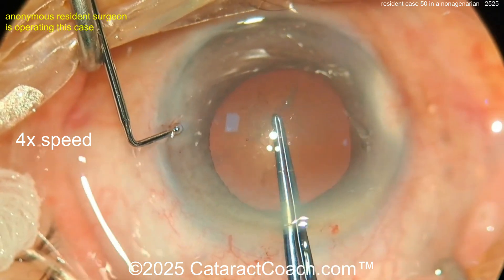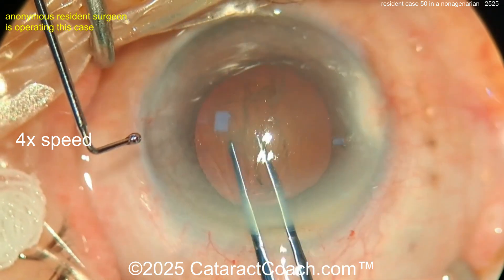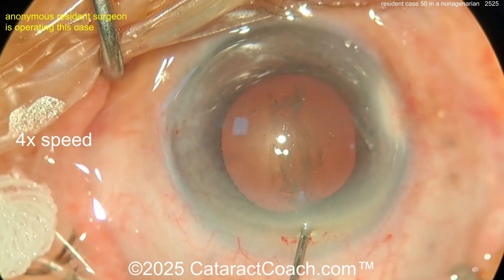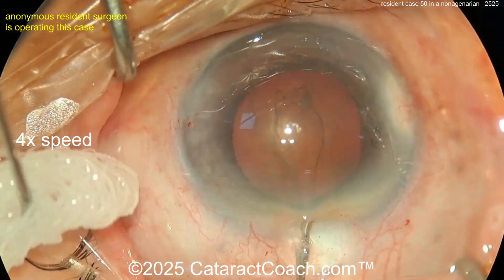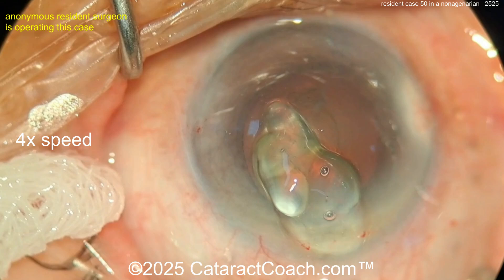The video is at 4x — four times normal speed. Unedited, without speeding it up, this video was 30 minutes. Is it okay to do a 30-minute cataract case for case number 50? Yes, perfectly fine — that's to be expected. Finishing up this rhexis is going to take some time, so we've got to be patient.